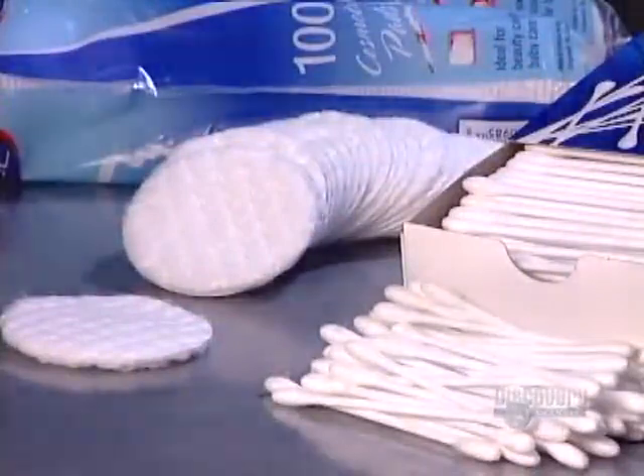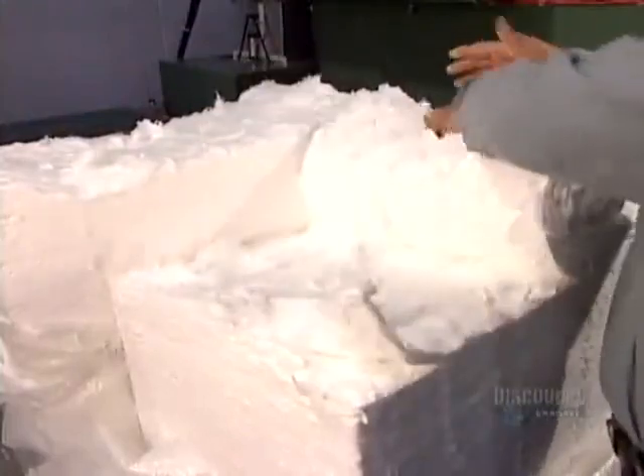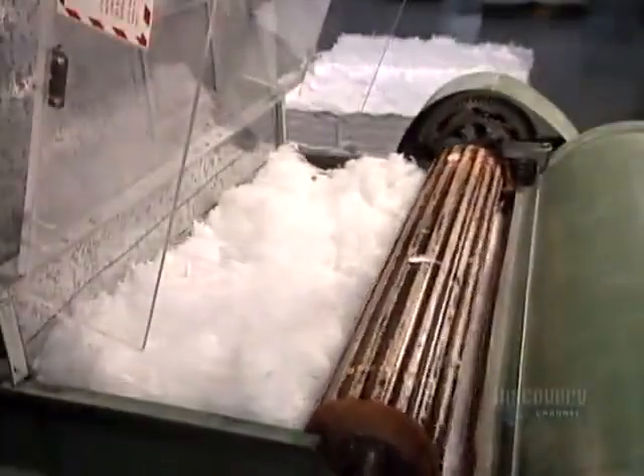Many cotton swab makers also produce cosmetic pads. Both start with bleached cotton, which arrives at the factory compressed in large bales. The cotton first goes into a machine called the feeder.